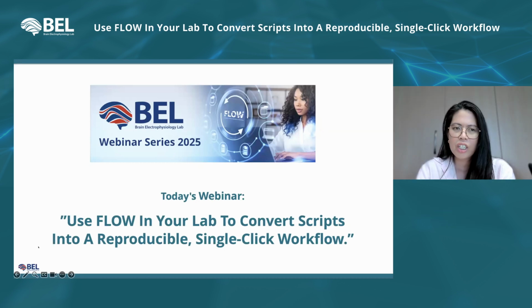Thank you for that question. In the introduction, I mentioned that we are also dealing with adult data. We have some datasets using high density EEGs as well as mobile EEGs with a low number of channels. And we are implementing the same pipeline that we use for infants. And in our experience, it's working well. So it's very extendable and flexible for all age groups.